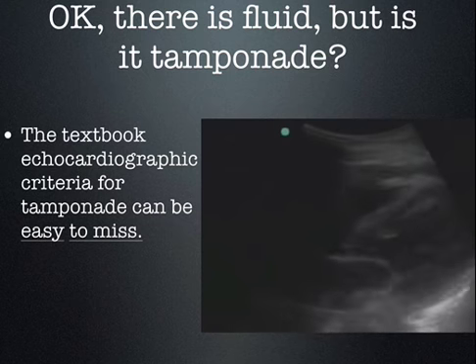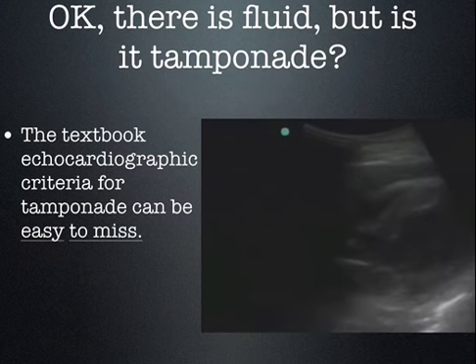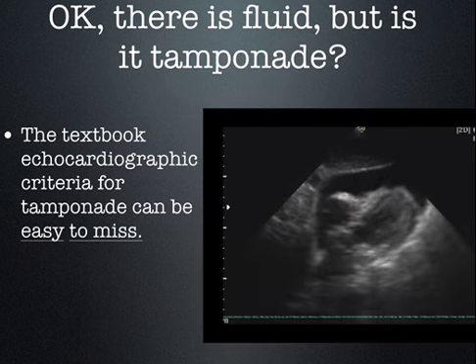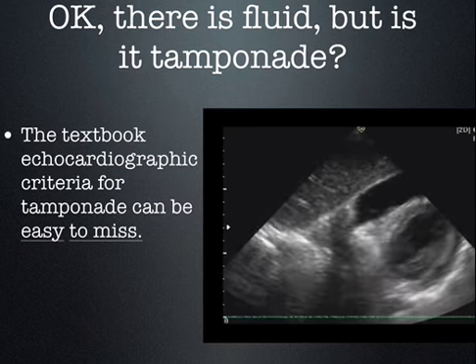So why do I put this up here? I put this up there because I want to illustrate how misleading it can be trying to do echocardiography for tamponade. It can be quite challenging. I want to submit to you there's an easier way. Now this one obviously, nobody's going to miss that. You see the RV is completely obliterated. It's not even expanding.